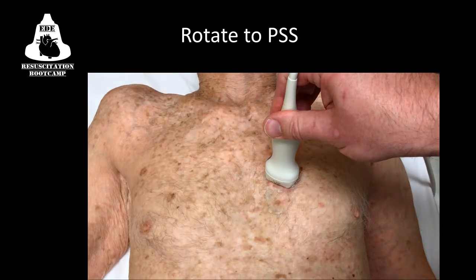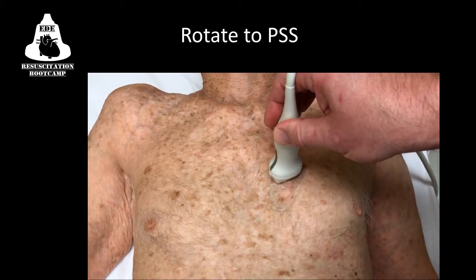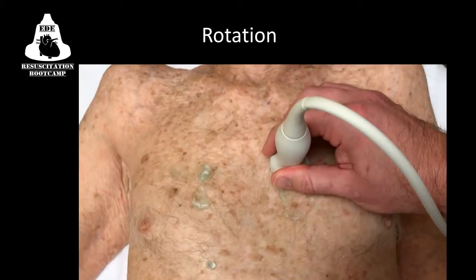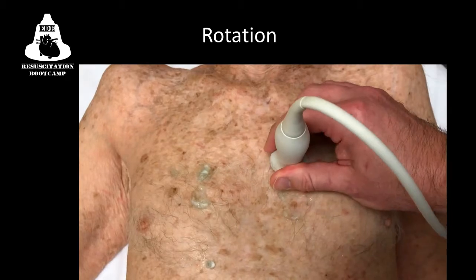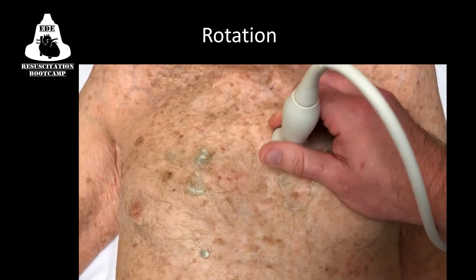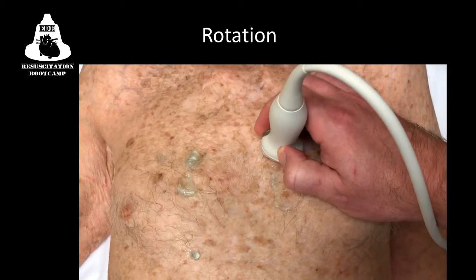Here you can see the probe rotating counterclockwise in an exaggerated motion. Note the operator would normally have the hand resting on the chest wall. For a well-controlled rotation, hold the probe near its business end and stabilize your hand on the chest wall. Use your thumb and index finger to gently turn the grip.